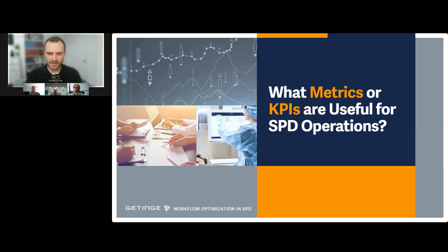So when we talk about data, people's eyes roll in the back of their heads when they don't have tracking systems, and they think, maybe someday I'll be able to do data. But there's good ways to do even what Steve just talked about on paper. If you're doing prep and pack and you have somebody assembling those instruments that just came out of decontam, and they find an instrument that's dirty, it is not much of an ask to have them put a tick mark on a paper form that gets turned in to your manager at the end of the day. You're already doing a quality piece. Why not try to capture the data of that quality piece and measure it? So really wise solutions there, Steve. Thank you for adding those.